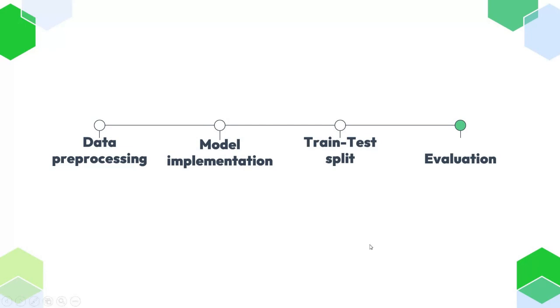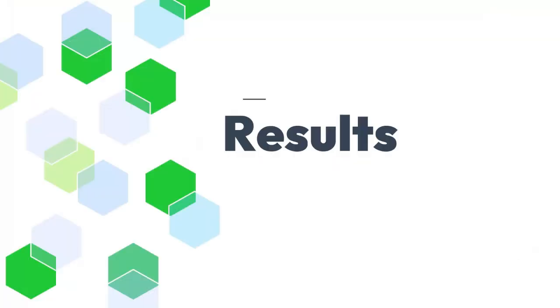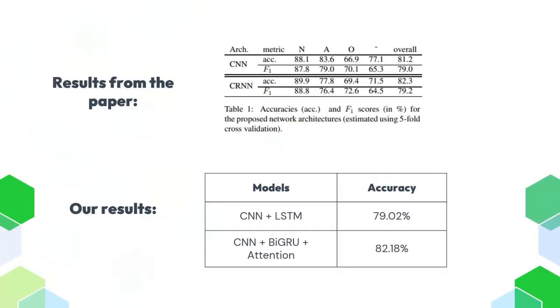This structured approach, from data pre-processing to rigorous evaluation, was essential in replicating the research paper and exploring potential enhancements. And with this, we are ready to move to the next section where we are going to discuss the results. The results were promising and our model demonstrated a good level of accuracy in classifying the ECG signals.